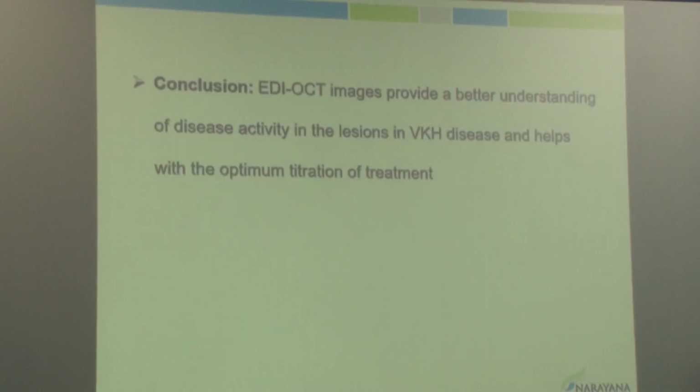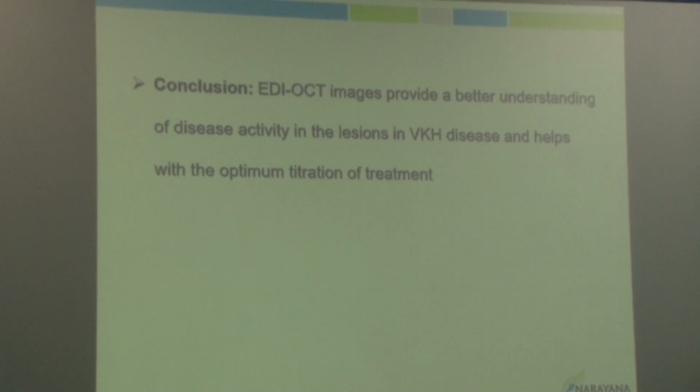So the conclusion is that EDI OCT images provide a better understanding of the disease activity in the lesions in VKH disease and help with the optimization of the titration of the treatment. The challenge that we face with OCT is that beyond the posterior pole, it is difficult to analyze the lesions and capture those images. So that's my talk. Thank you.